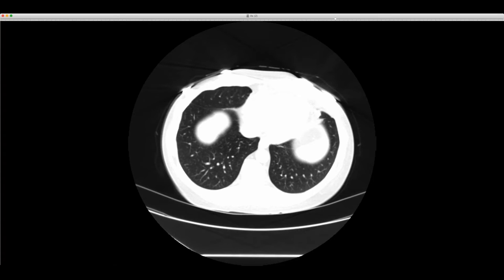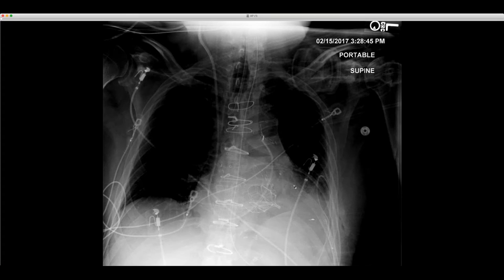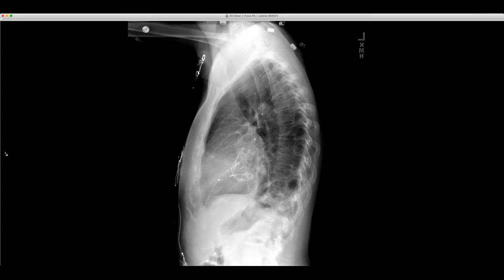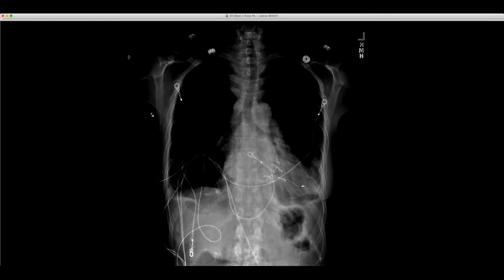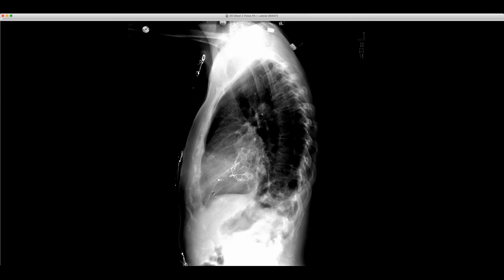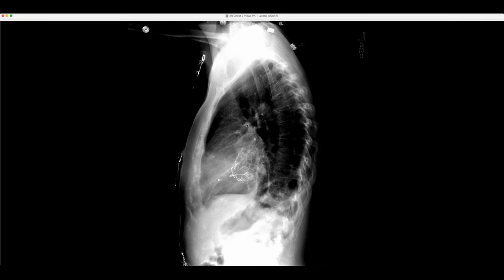I just want to quickly show this one. This is a portable chest X-ray — don't know if people have been seeing these pop up yet. You can see this device projecting over the mitral valve plane. What looks like a clip is actually part of this device. And a two-view radiograph on another patient shows the same device — this expandable device at the mitral valve, with an anchor point. Let me bring up the video of what this is. This is the Tendyne bioprosthetic mitral valve system, implanted through a left thoracotomy via an apical approach through the ventricle.